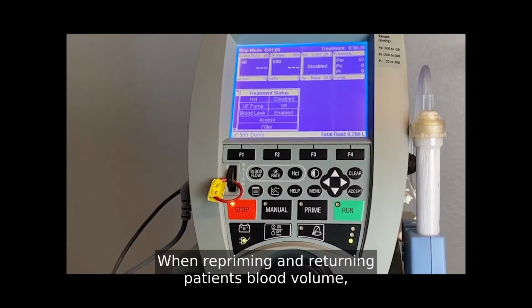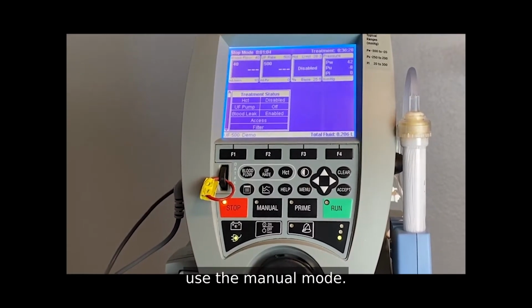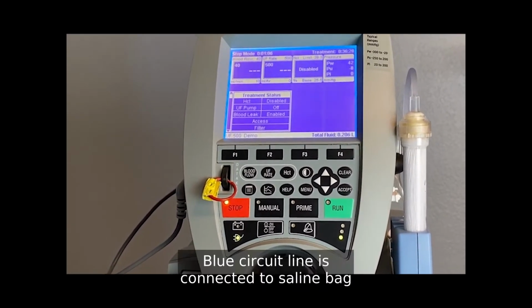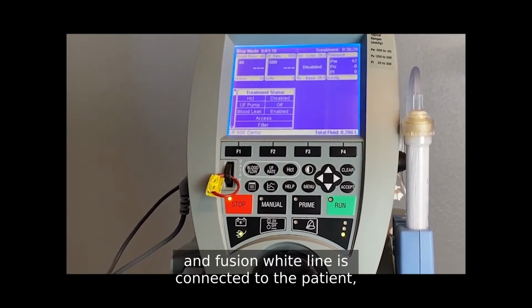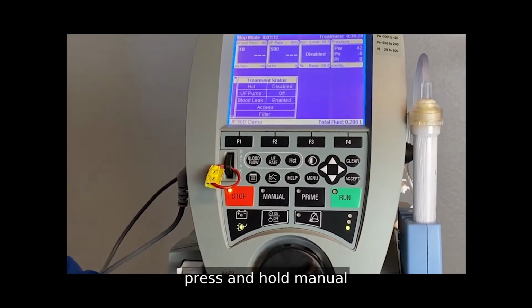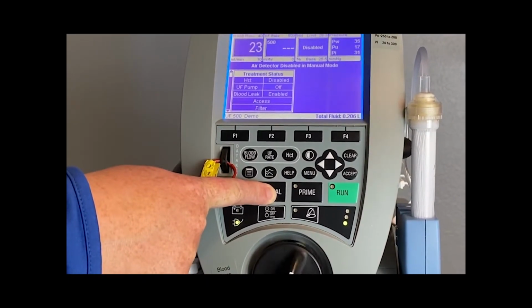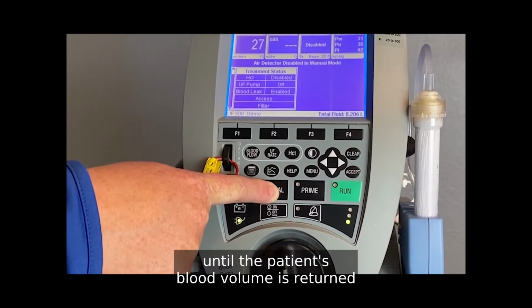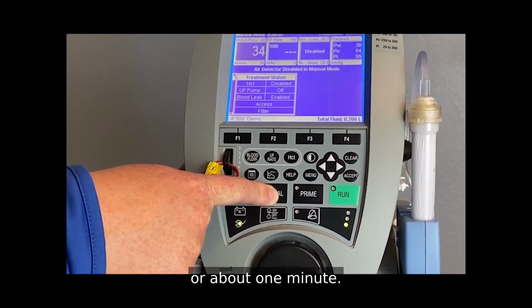When repriming and returning patient's blood volume, use the manual mode. Blue circuit line is connected to saline bag. Infusion white line is connected to the patient. Press and hold manual until the patient's blood volume is returned, or about 1 minute.